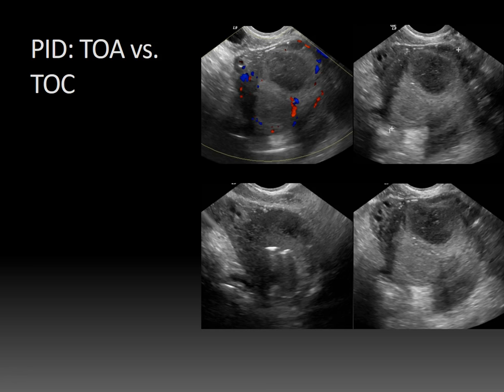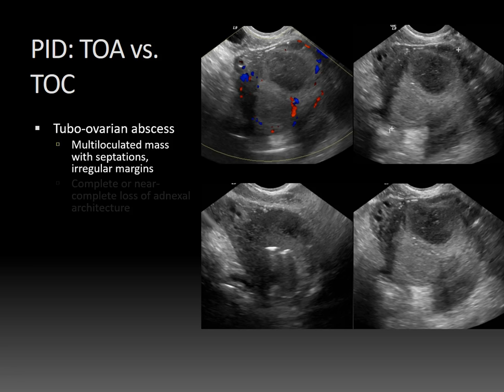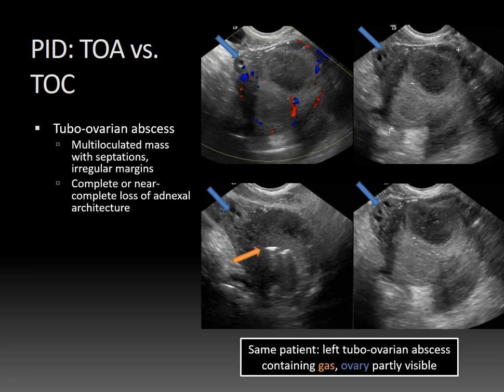Looking at that same patient on ultrasound, a tubovarian abscess will be a multi-loculated mass with septations and irregular margins. You'll have complete or near-complete loss of the adnexal architecture, meaning you normally won't see much normal ovarian tissue. In this case, you can see echogenic foci with dirty shadowing within the abscess indicating gas, and a bit of distorted, partially imaged normal ovary — this is a typical tubovarian abscess.